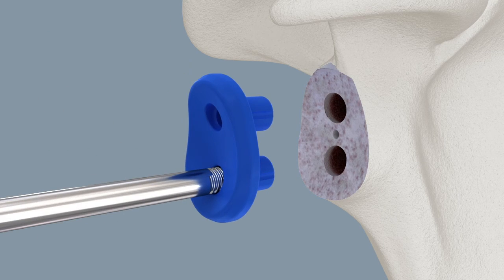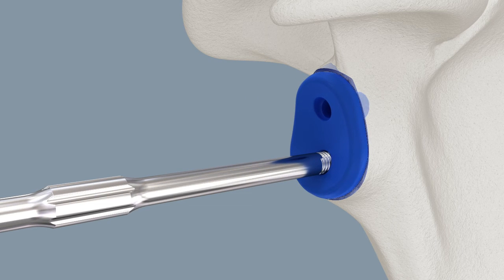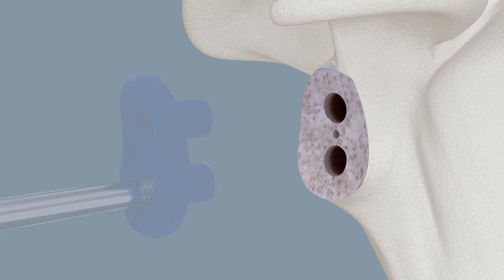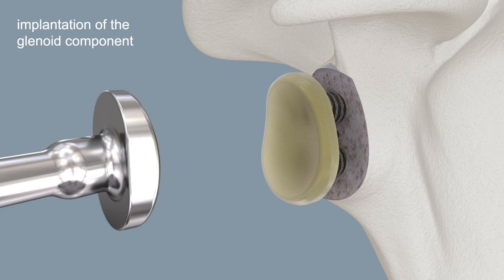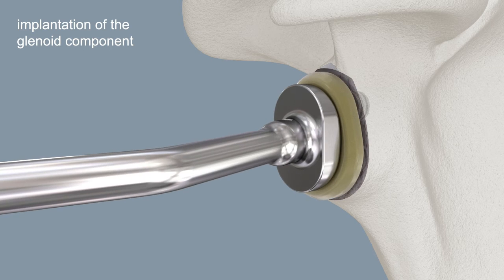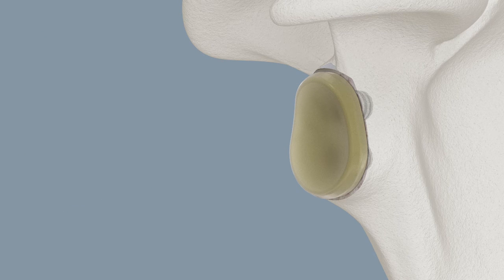Select and insert the appropriate trial glenoid. Insert the Affinis glenoid Vitamis uncemented. Carefully use the glenoid impactor to drive the pegs into the holes.